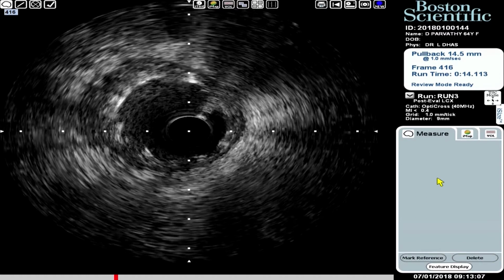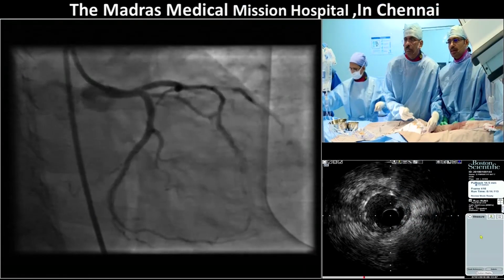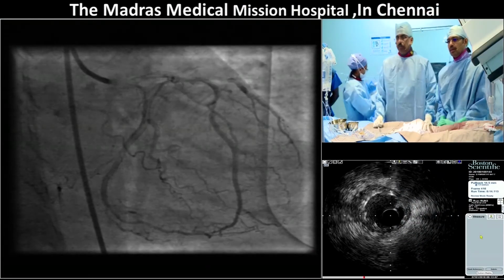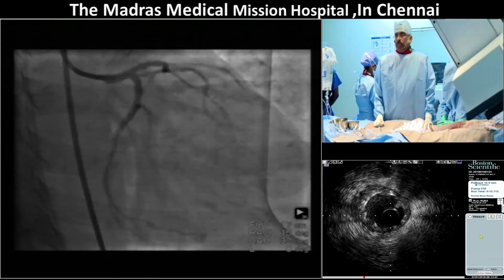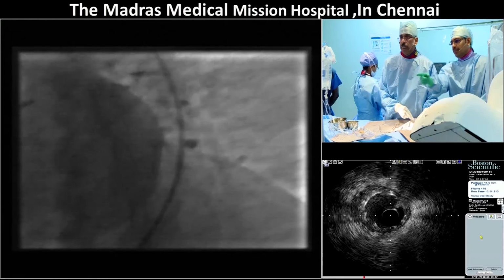Yeah. So we'll just take another shot and then go after the right, which is what we were planning to do before you came on live. Okay. Perpendicular view, please. It is a good result. I don't think you should chase me.